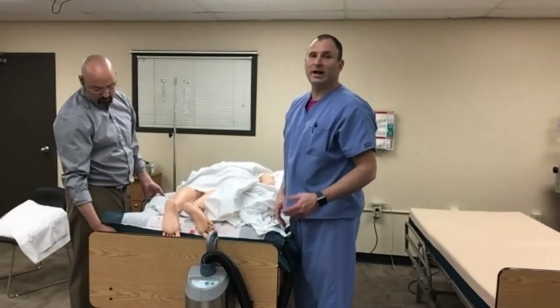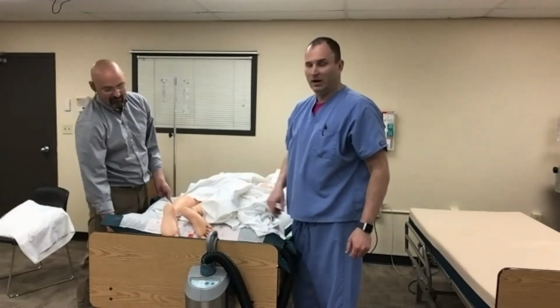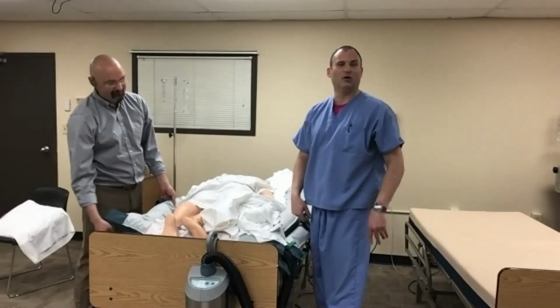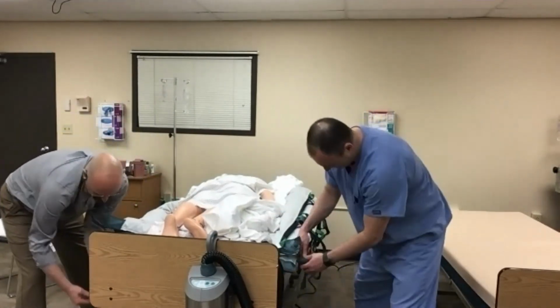Now, we didn't do that as well as we could because we didn't do it together. So we kind of pulled differently, but because the air was inflated, we had time for him to catch up because I got a little overzealous. So we're now going to anchor the mat back in place.